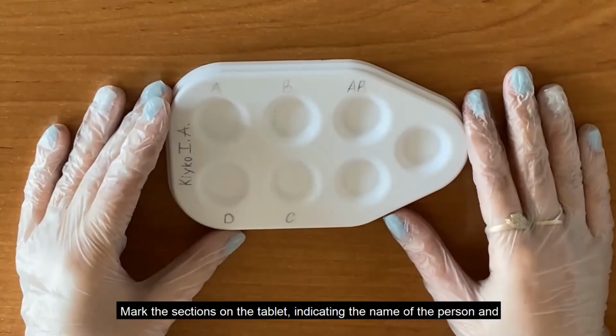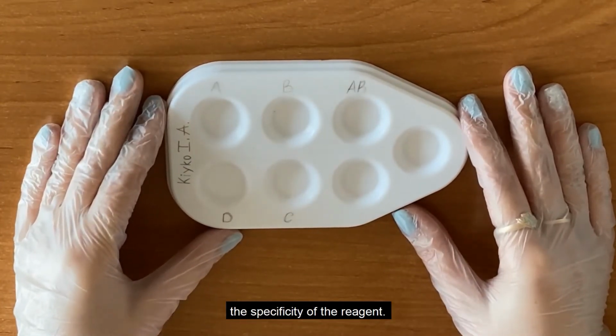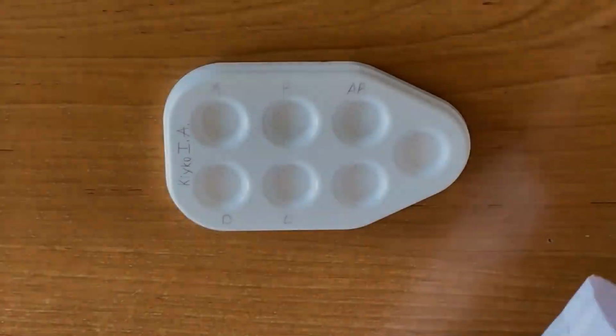Mark the sections on the tablet indicating the name of the person and the specificity of the reagent.